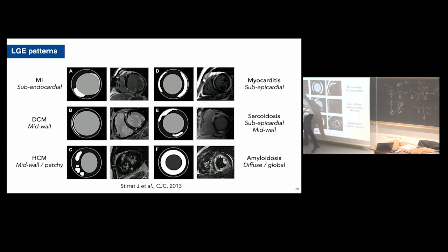For hypertrophic cardiomyopathy, we'll have patchy enhancement on the images, mostly located on these two areas here. So you see the power of LGE to classify the cardiomyopathies. What we're looking at today is the subendocardial scars. We need to now measure the size of this scar. Is it above 19%, as the German paper was saying, or below?